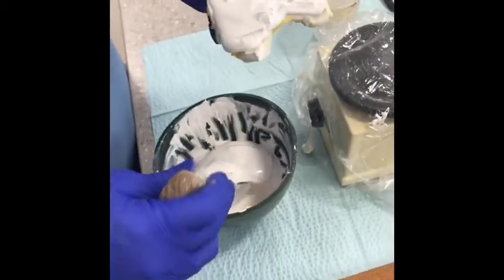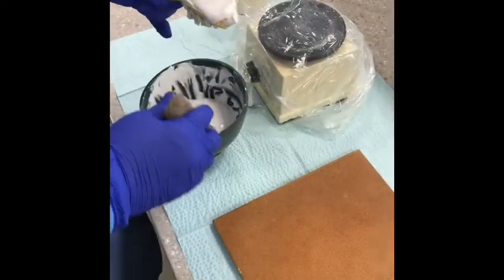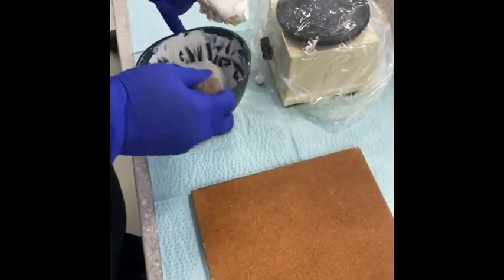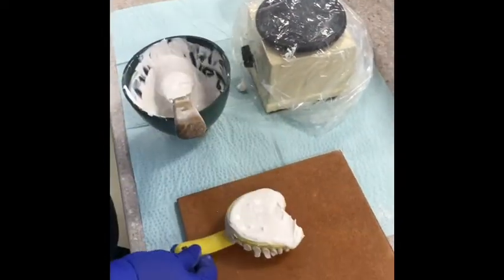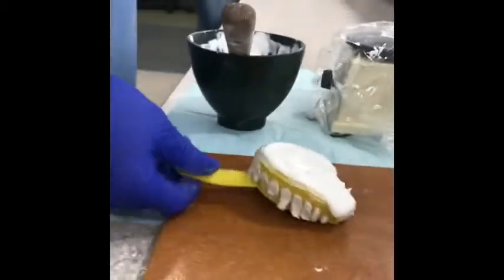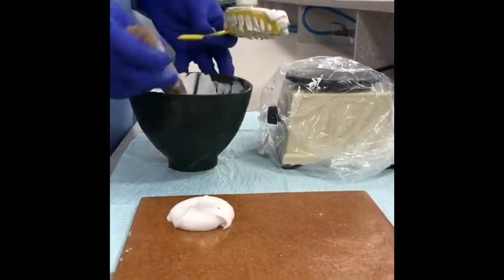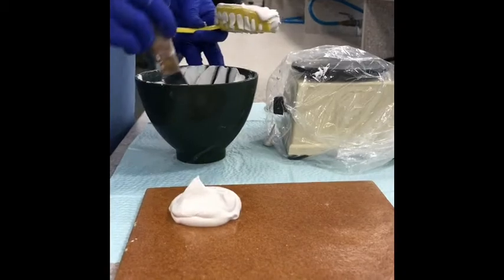I'm going to show you a different technique to build up the base versus what we did for the stone. With the stone, we just had the tray and stacked the materials. We're going to do a different method — it's called the inverted. You're actually going to pile on your excess plaster onto your tile.